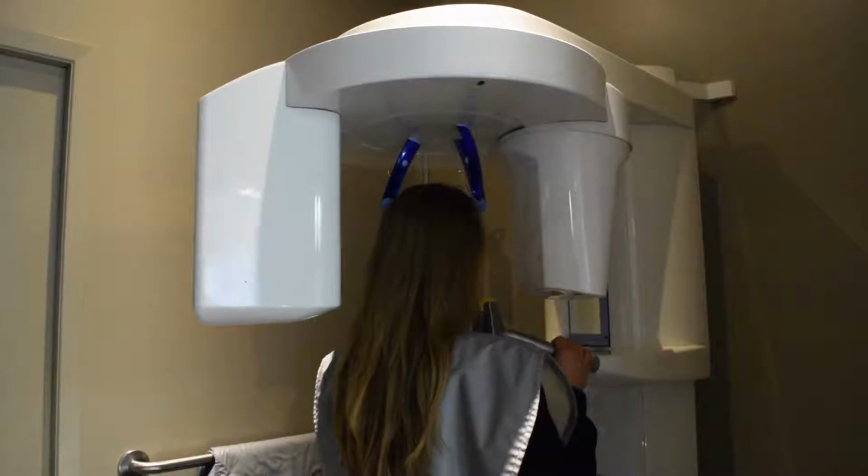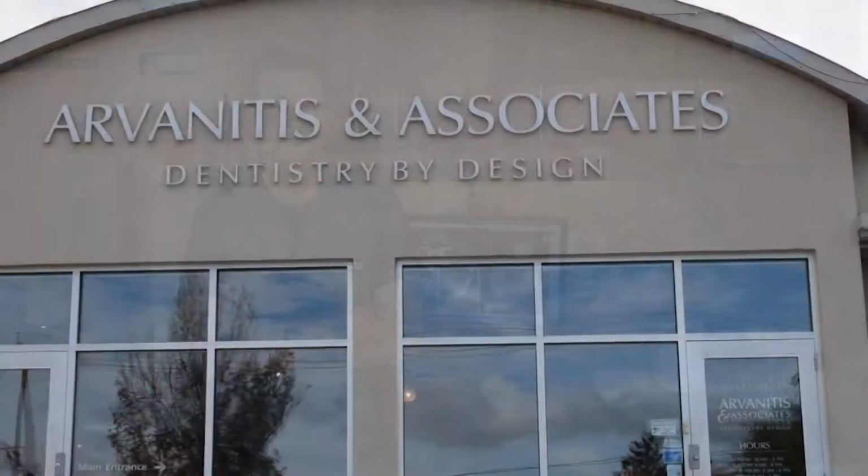Today I'm going to be showing you one of the technologies that we have here at my clinic, and it's called a CBCT, or basically it's known as a CAT scan. So let me get into a little bit how we use it and introduce you to the technology. So let's get started.